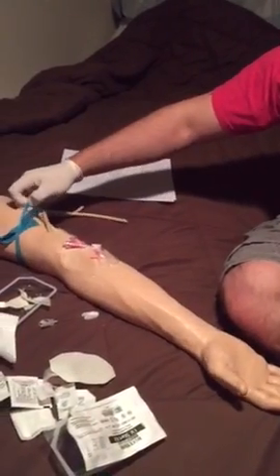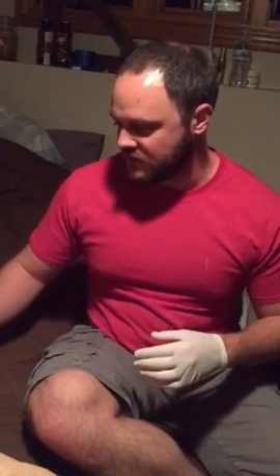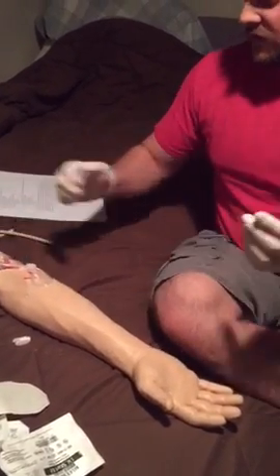It used to be just TKO, to keep the vein open. That's not really used anymore. Now most medical directors want some sort of number at a drip rate. For this, if we were just to keep the vein open, we would do it 6 to 10 drips. 6 to 10 drips in a minute. It's not really a whole lot, but it's just enough to kind of keep the vein open and ready to give medication. If we were giving the fluid, we could open that up.